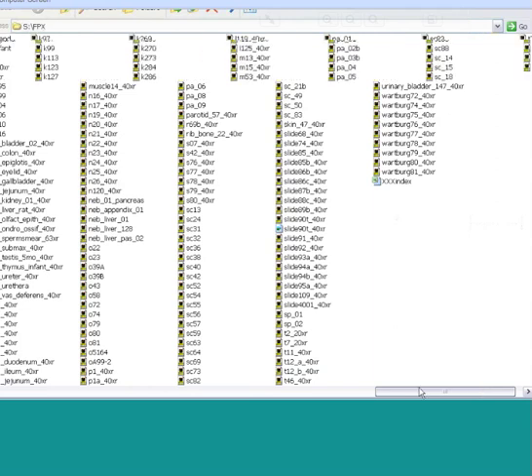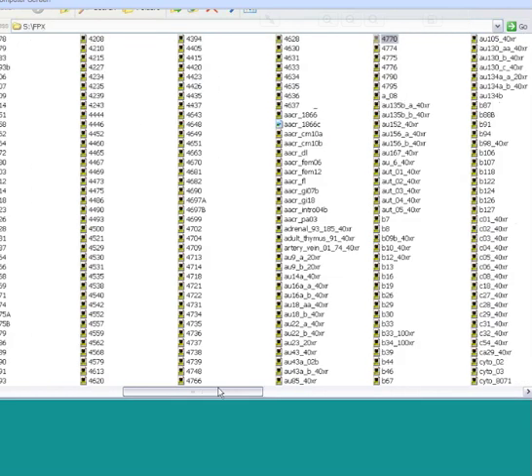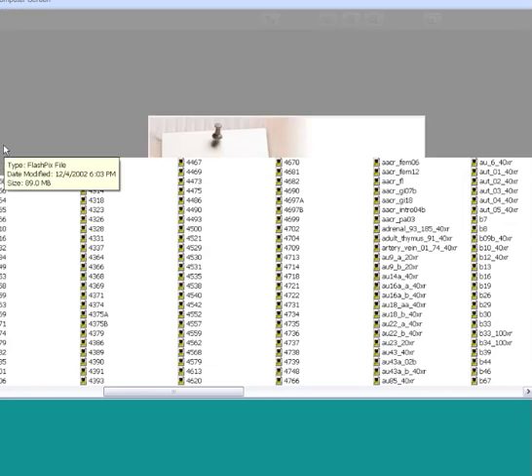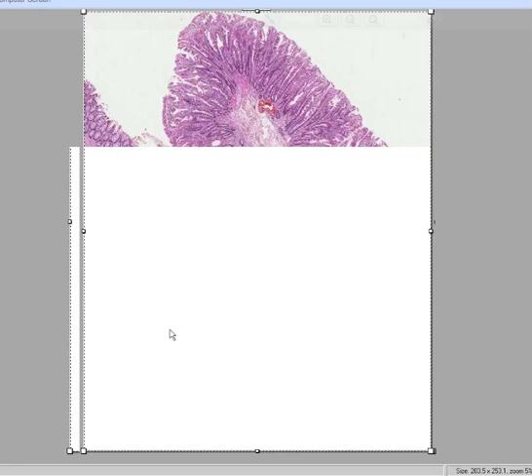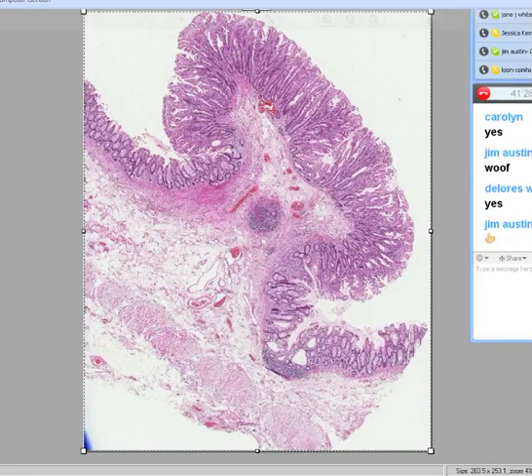No, let's go to this one. 4043. Okay, probably in about 8 seconds, you're going to be seeing something here. And I just saw it myself right now. So I'm assuming that you're going to be seeing it in about 10 seconds. And don't tell me Jim sees it already. Oh my God, everybody sees it quick. I'm feeling really good now.